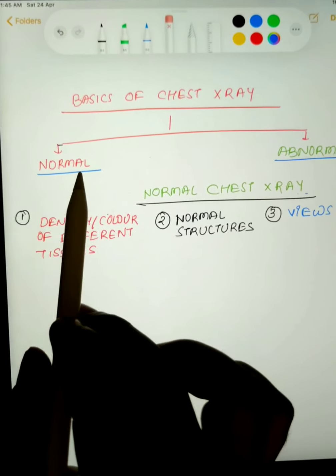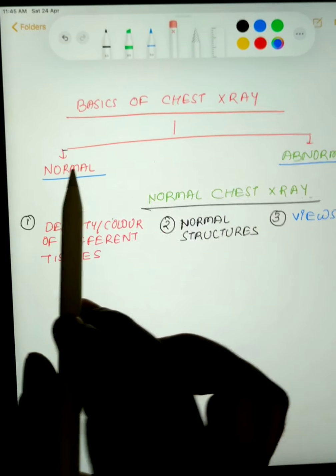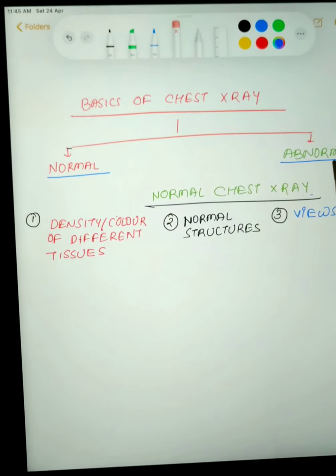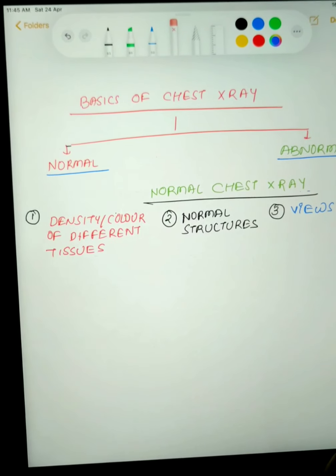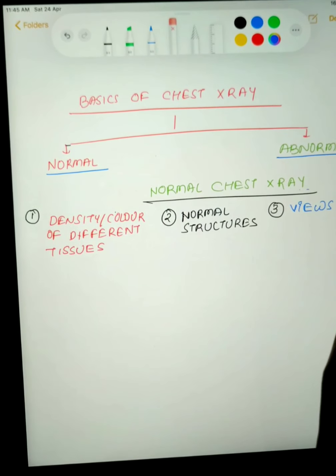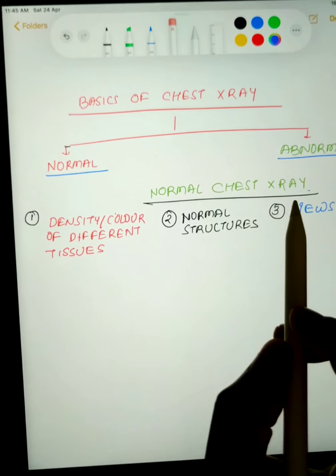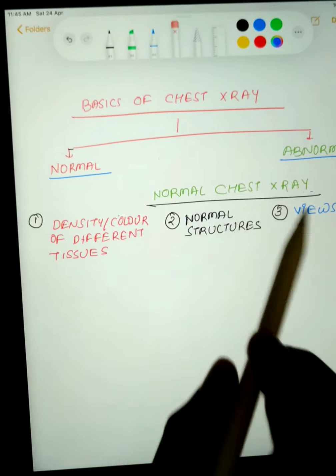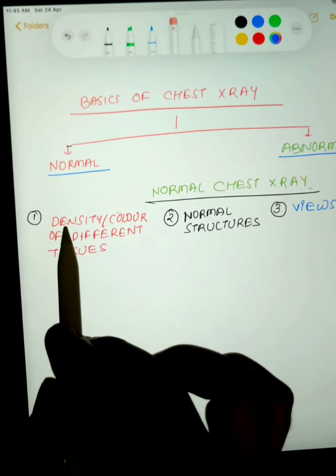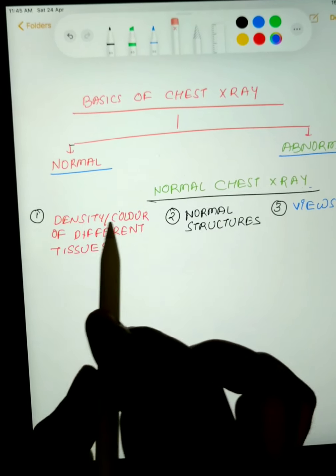Hello friends, today we will learn about basics of chest X-ray. First we will learn what is the normal chest X-ray, and then we will see the different kinds of abnormal chest X-rays.